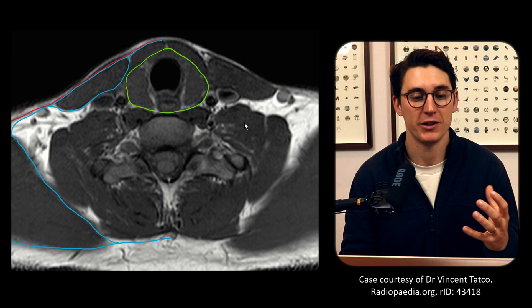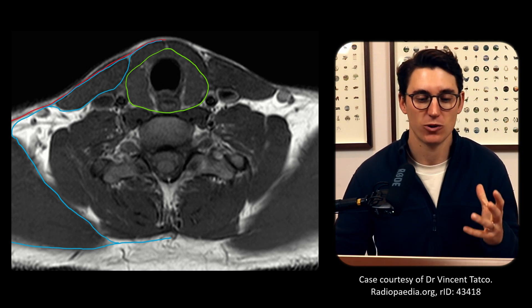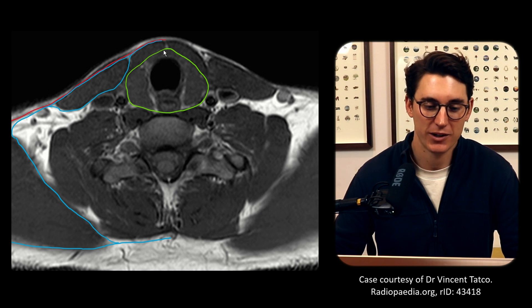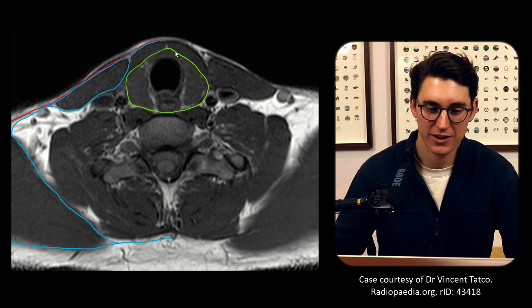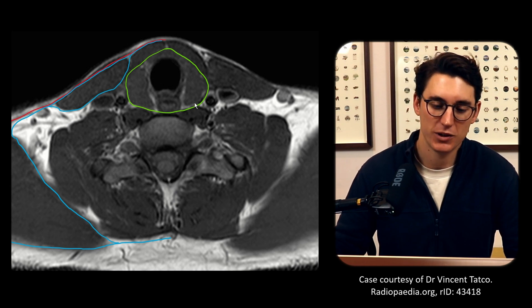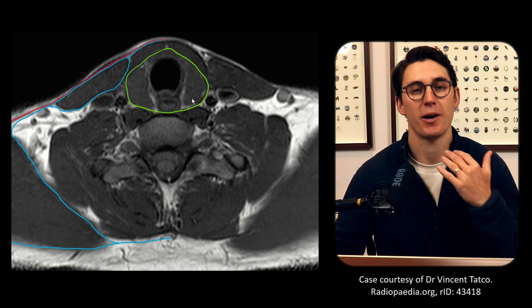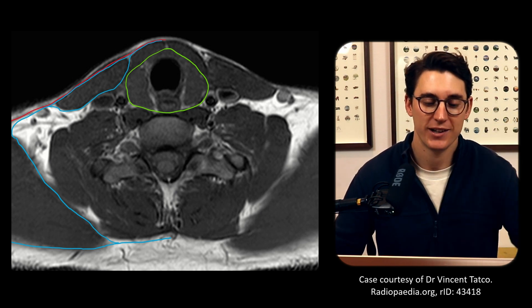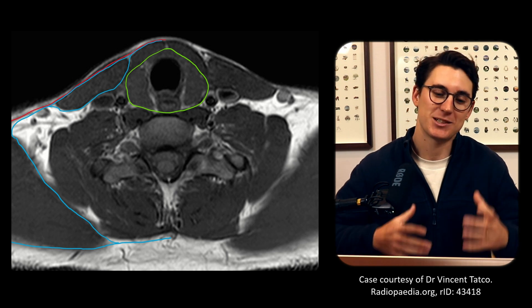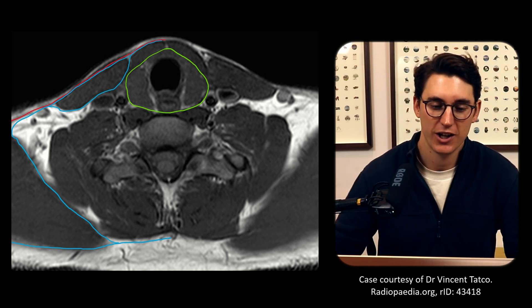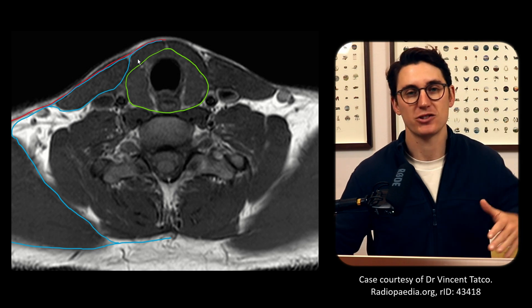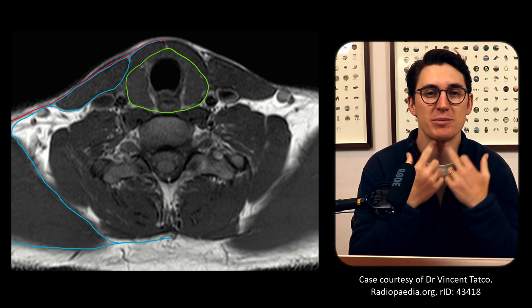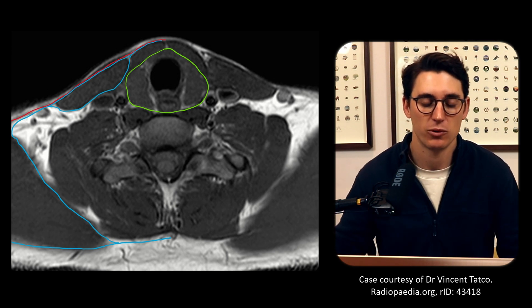The next plane is our middle layer of our deep cervical fascia — in textbooks you may see this called the pretracheal fascia, but as radiologists we call it the middle layer. It encases our trachea, our esophagus, our thyroid gland — you can see the thyroid isthmus here — and obviously our parathyroids. That space heads all the way up to the hyoid bone. It also provides the fascial border on the posterior portion of our strap muscles. Strap muscles are so called because they look like belt straps or bag straps heading from our hyoid bone to various portions of the neck.